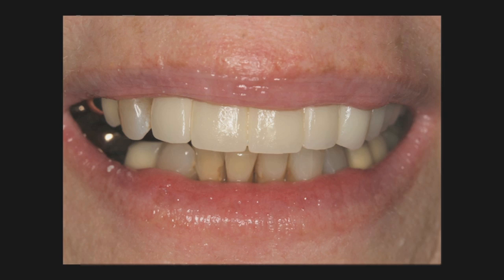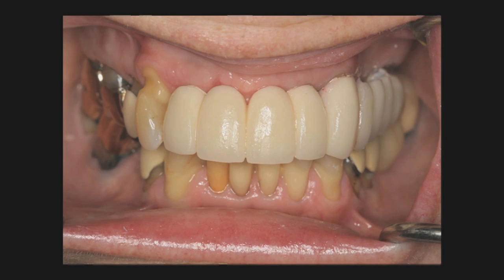So while they were fabricating the immediately placed bridge number 7 through 10, I asked them to create a temporary bridge number 11 through 14, maxillary left cuspid all the way to the molar area, to be seated at the time of delivery of the maxillary anterior bridge.